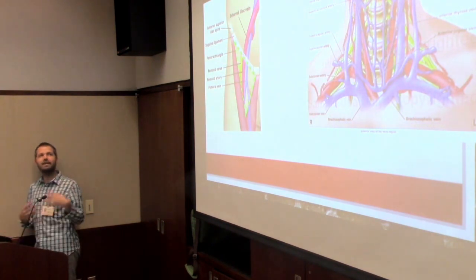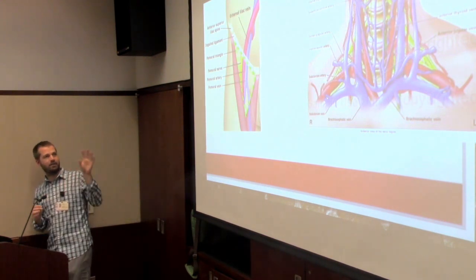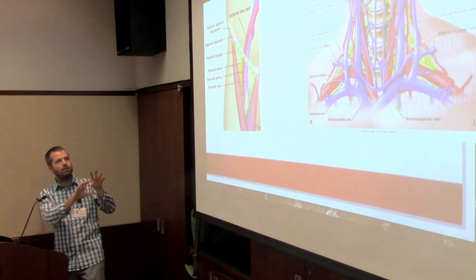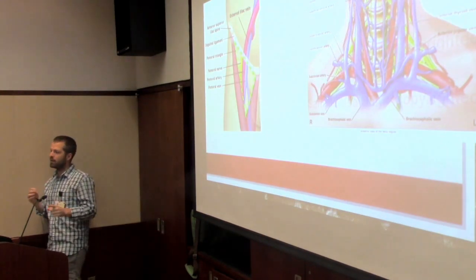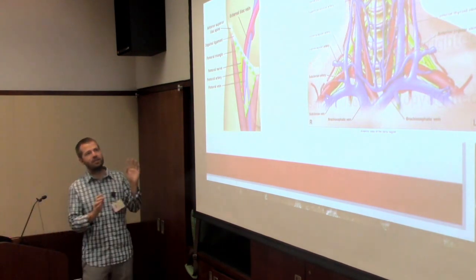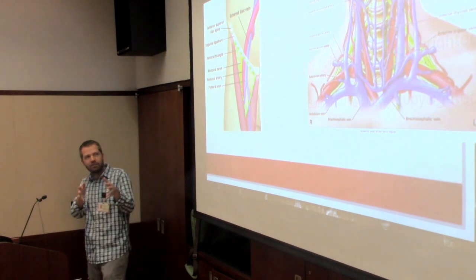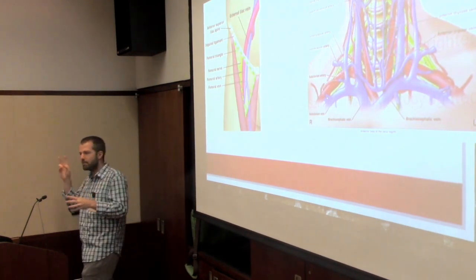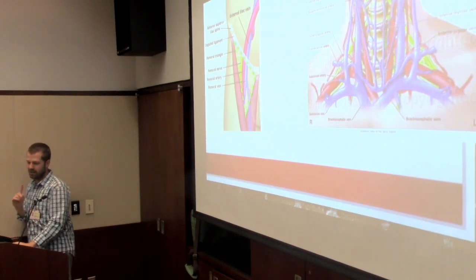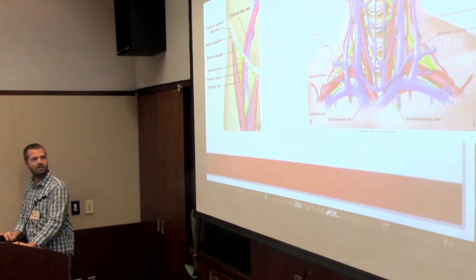So more of just anatomy in 2D. You're like, all right, well, I read a textbook and I saw that the vein is medial to the artery, and the femoral nerve, artery, vein, navel. Cool, I can remember all that stuff. In the neck, there's a whole bunch of gibberish. In these pictures, it looks like my IJ is outside and slightly in front of my carotid. So I'm going to memorize those things, and that's how I'm going to distinguish where stuff is. And we're going to come back to this. So I got these giant 2 vessels, and I want to stick something inside them.